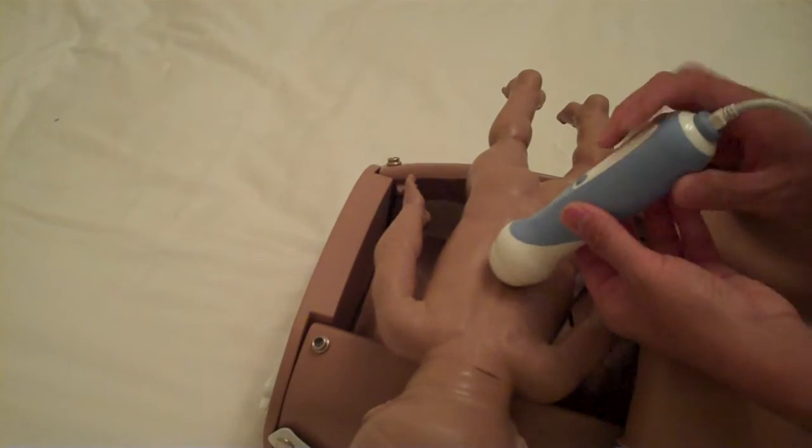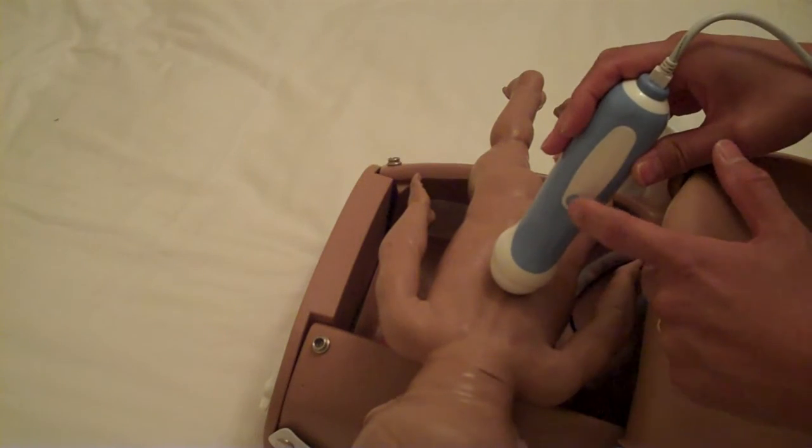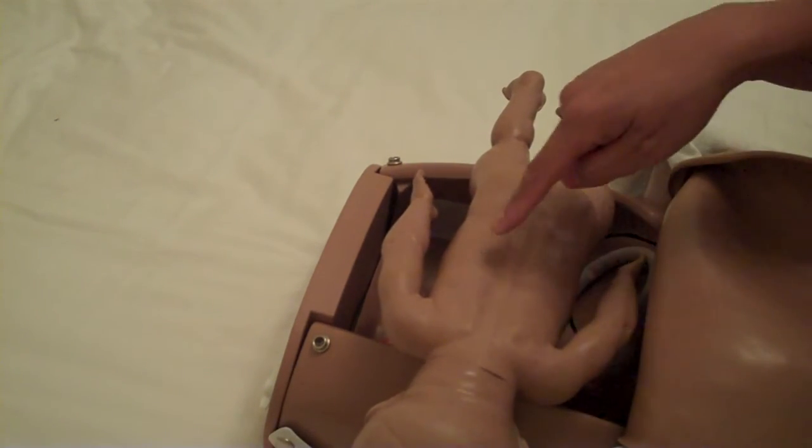As opposed to this cut with the dot pointing this way, now you're going to be cutting it like this, so you're going to be able to see the baby's spine and everything. So that will come up as like a line, okay?